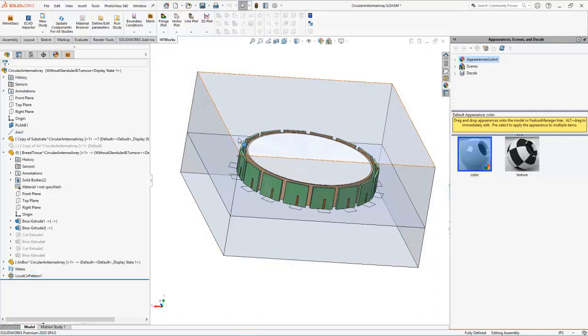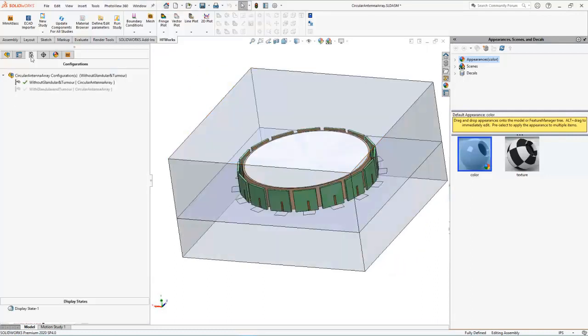This is an assembly inside SOLIDWORKS. SOLIDWORKS offers the ability to create different configurations. So, you can see here, I have two configurations. I have a configuration for the breast without glandular and tumor. What is shown now is the active configuration, so that's my current configuration.